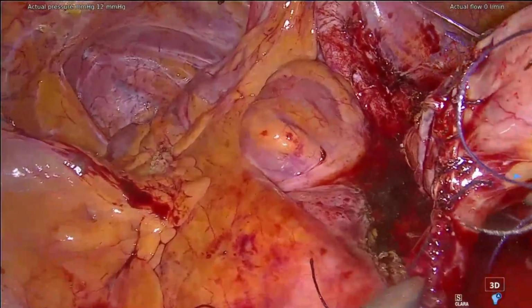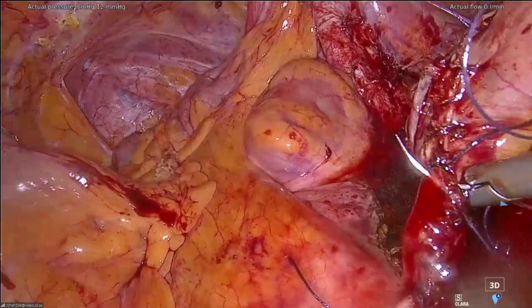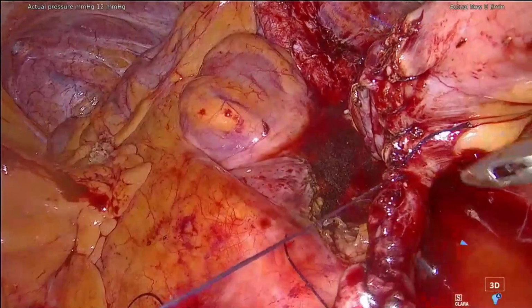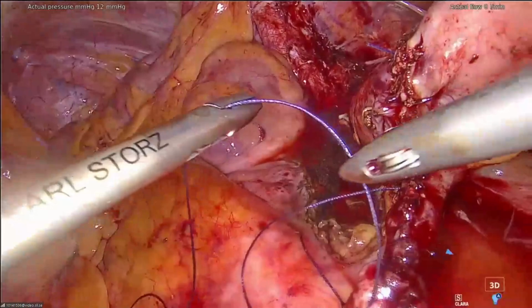We have used the bowel wall for this reconstruction. Renaud, since this is a pedicle flap, do you respect the rule of plastic surgery of the ratio 3:1 from the base of the length or not? You don't care? No, not for this. In the Monti, you don't need to respect that rule.